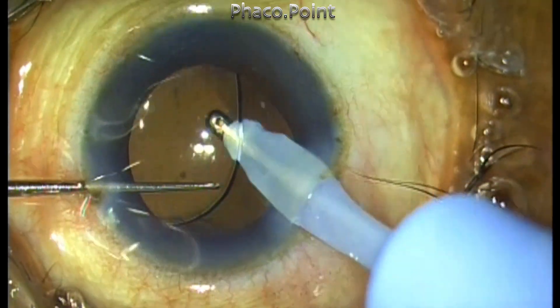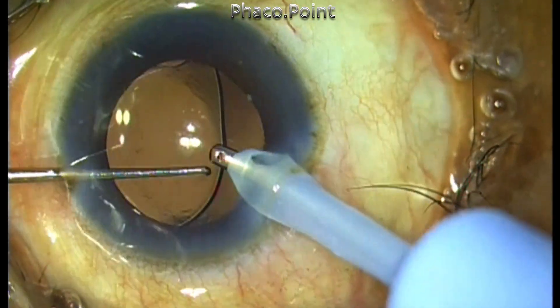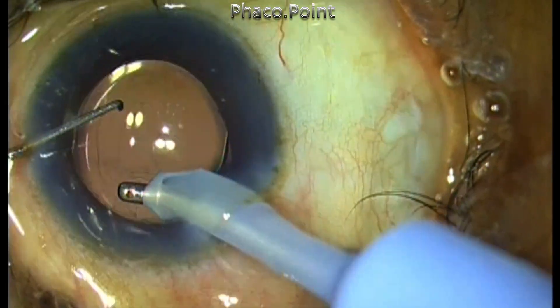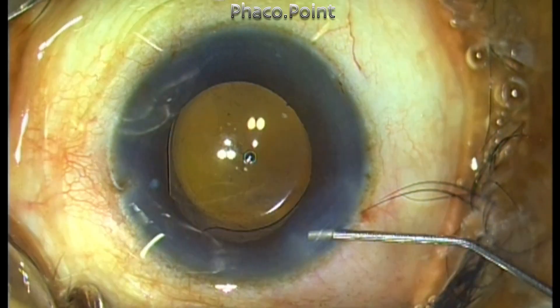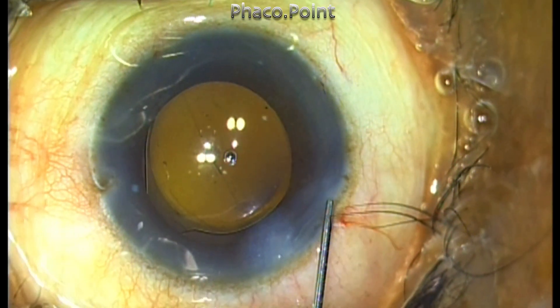This completes the case. Remember, if you end up with a small capsulorhexis, do not persist with phacoemulsification. It always makes sense to put in some viscoelastic, make a small nick, and enlarge the rhexis to the desired size so that you can avoid the problems associated with small rhexis phacoemulsification. Thank you for your attention.